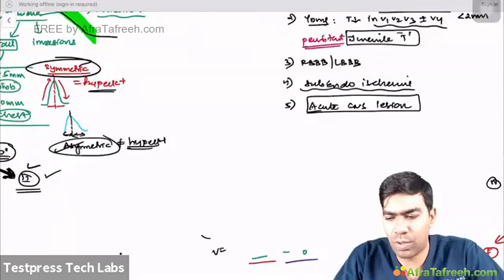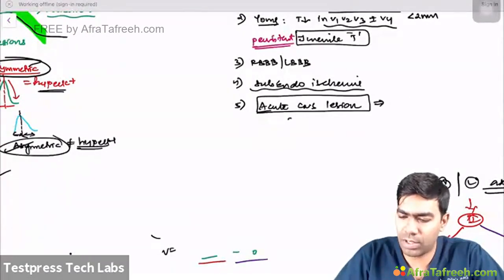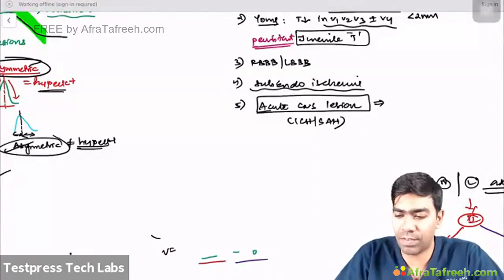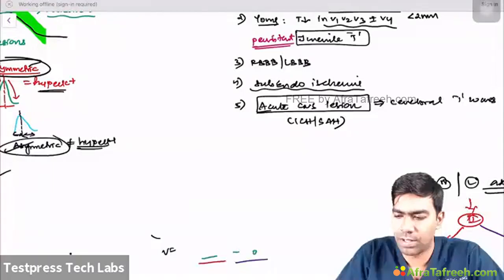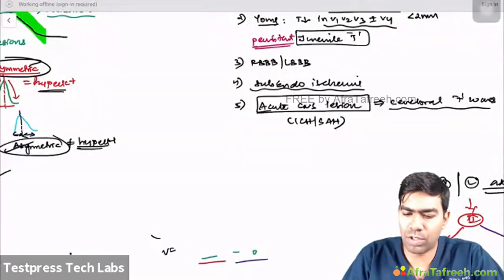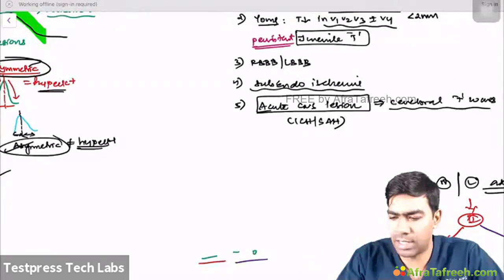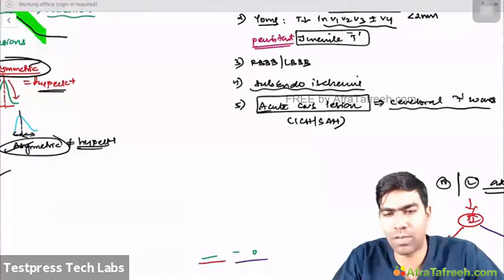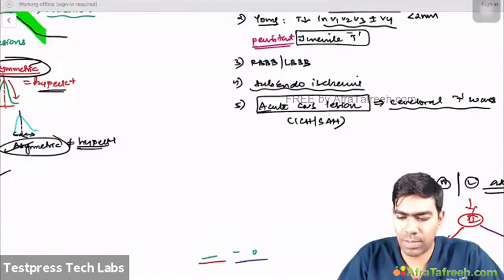Whenever you have an acute CNS lesion, these are called cerebral T waves or cranial T waves. So, for example, you can get it in ICH or probably in subarachnoid hemorrhage. You can get severe T wave inversion. These are called cerebral T waves. The name is very important. Of course, you know the clinical picture here. The patient will be in coma. If it's causing involvement of the ECG because of a cranial central lesion, of course the patient will be knocked out and unconscious. So that is a cranial T wave or cerebral T waves.